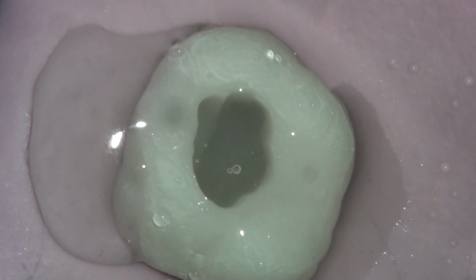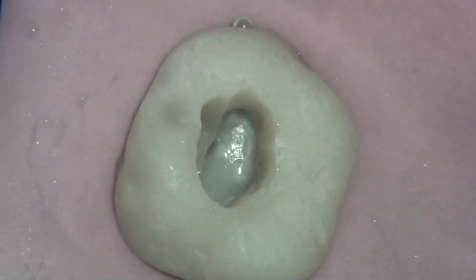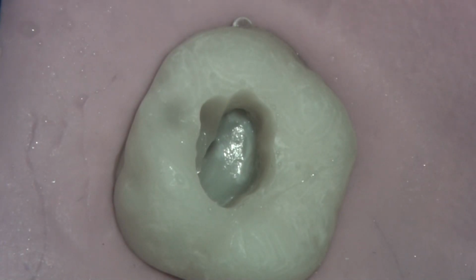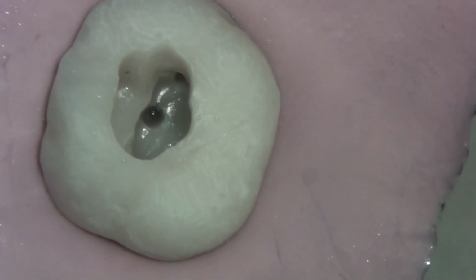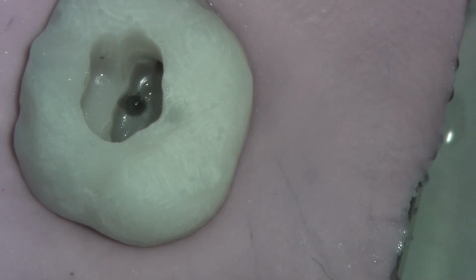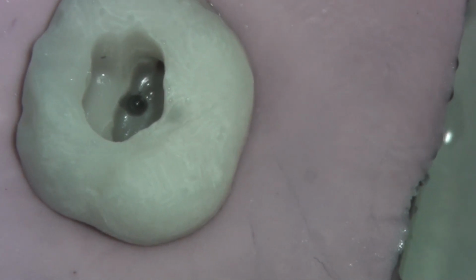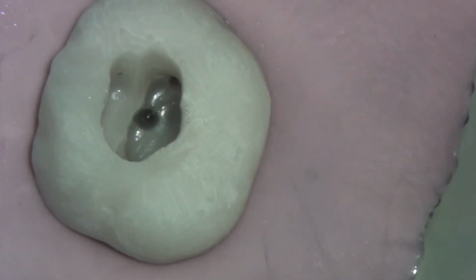And just as an illustration in terms of where we end up, we'll spray some air just to see what the floor of this pulp chamber looks like, and importantly what this prepared second mesiobuccal canal looks like. And you can see it in relation to the MB1. You can see the nice coronal shape that's been created. And so now at this point we are ready to dry and obturate.